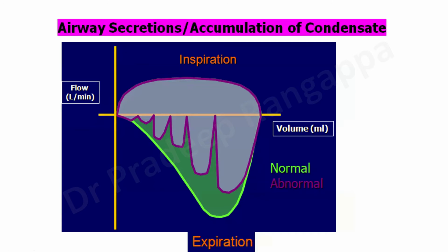So basically what I've tried to show you is how the gas flow or the flow dynamics, flow time or flow volume can help you determine the various pathologies. The various pathologies that we discussed are obviously bronchospasm and auto PEEP, and then increased secretions, airway resistance, and air leaks. So these are the 5 pathologies that you can recognize in flow dynamics. This is what one should appreciate when you're looking at the flow time or the flow volume loops.